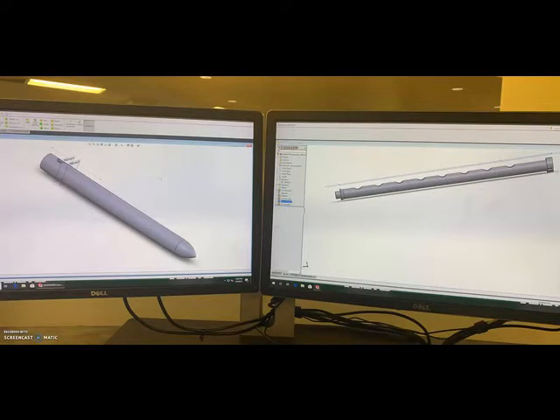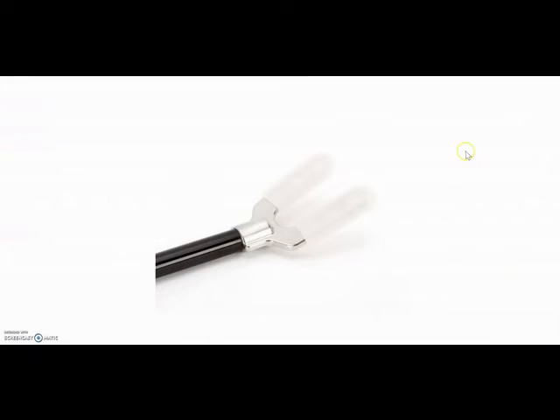The mouth stylus has gone through many changes since its initial design, and I look forward to keep improving upon it even after the end of this class. My next step would be to add some sort of mouth guard to the end of it so that the patient can more comfortably hold it in their mouth for longer periods of time.